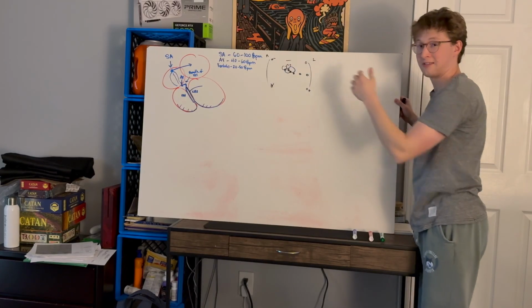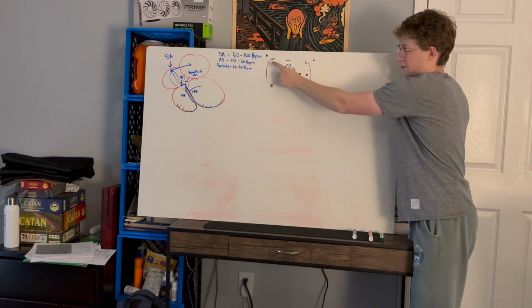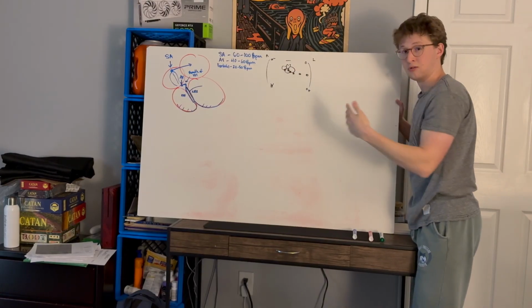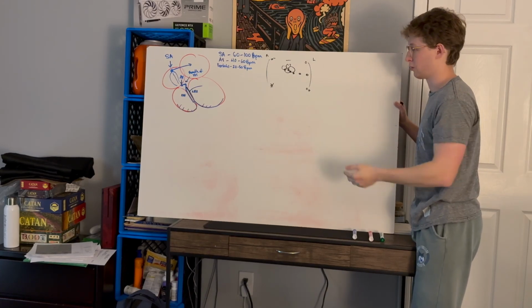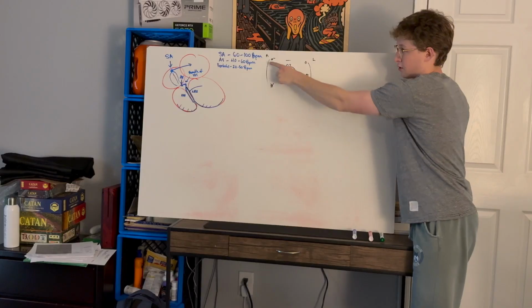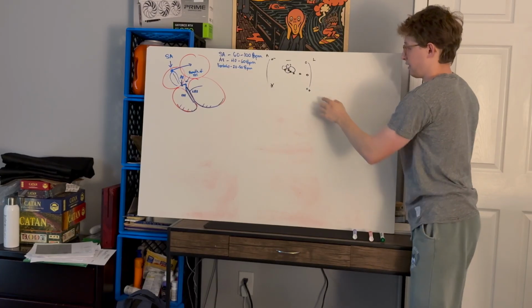This one that's set to negative is your reference point. So the machine takes this positive and this negative, and all it's doing is measuring the change in voltage in the heart due to action potentials and impulses, which are depolarization and repolarization. And it's just measuring the movement between this negative reference and this positive viewing point. So this is lead 2.